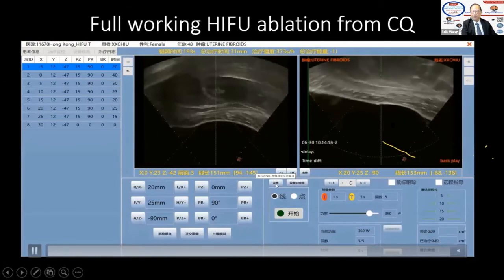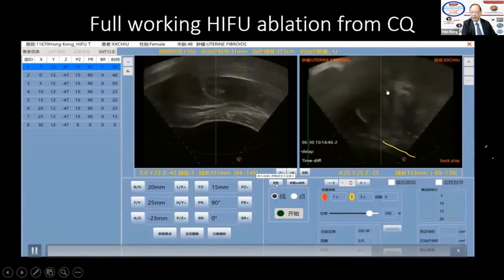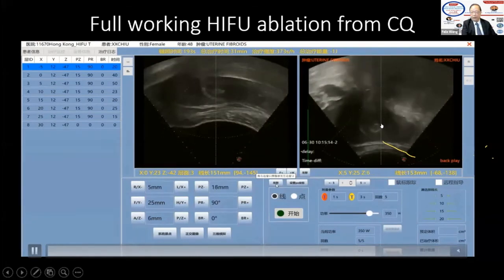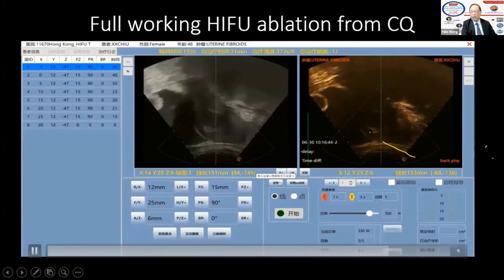And now, when we think we are more or less finished, what we are going to do is inject microbubble again. We wait until you can see the fibroid and that it has been burned. There's the microbubble over here. Now one thing is we are using oxytocin. You can see there's no perfusion in the fibroid. So I'm turning it from one side to another.